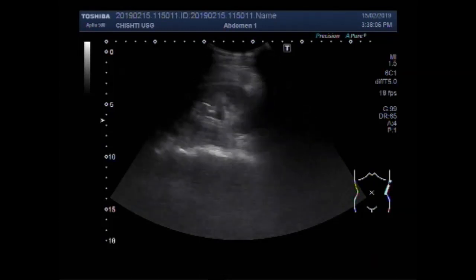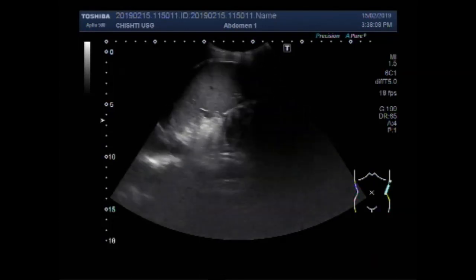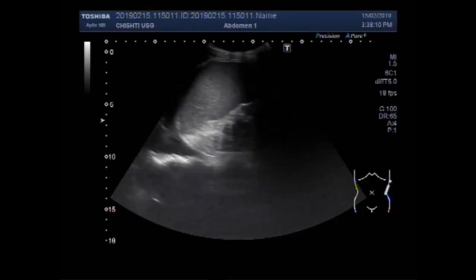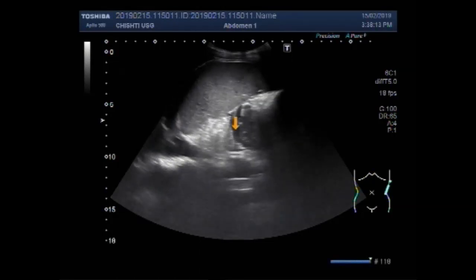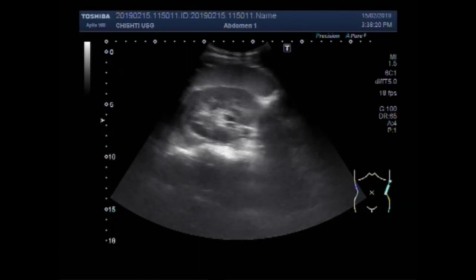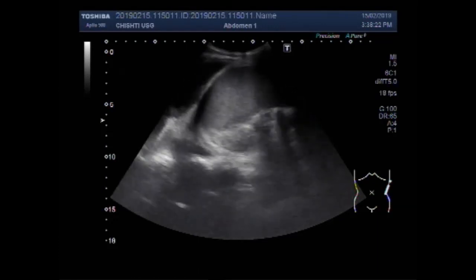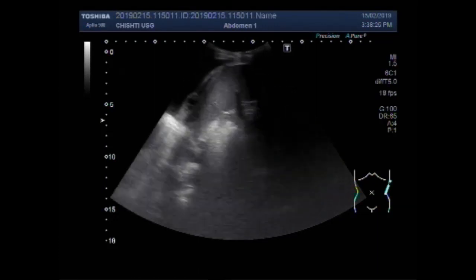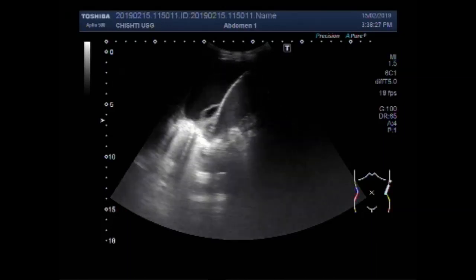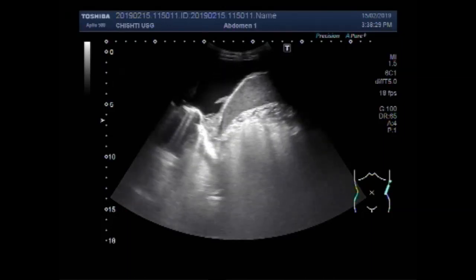You can see this is the left kidney. Now you can see the spleen. This is left pleural effusion. The left kidney and spleen are visible. Now you can see the fluid in the pleural cavity. This is the spleen, and this one is the pleural effusion.